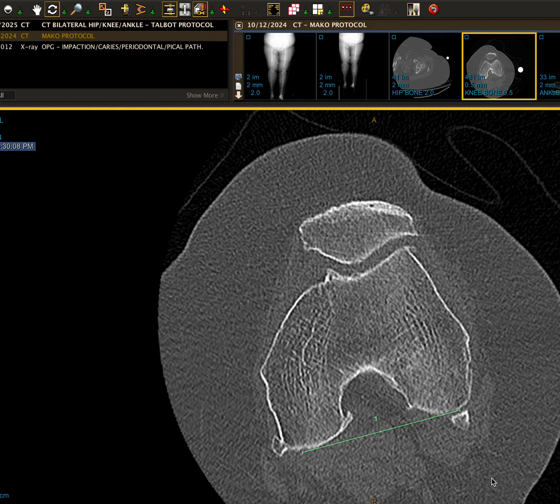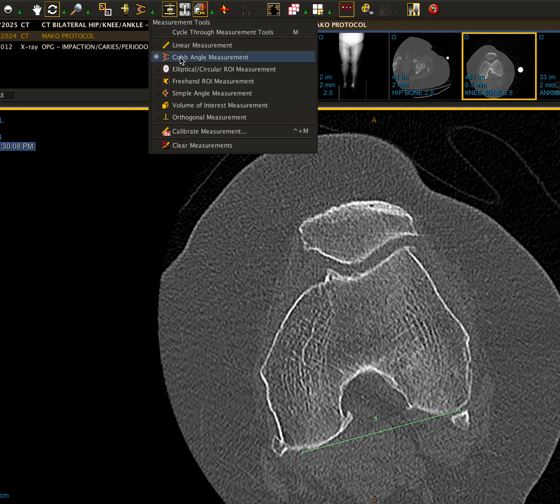For this demonstration I'm using the IntelliViewer software program, though all standard viewing programs can perform these same measurements. You'll see in the menu bar some tools I'm going to use today: the rotation tool, the Cobb angle measurement, and the circular measurement tool.